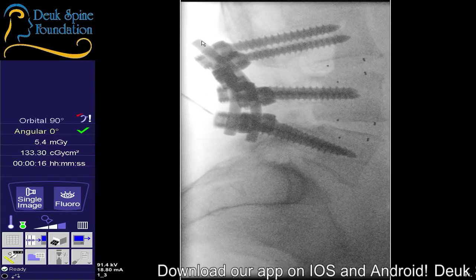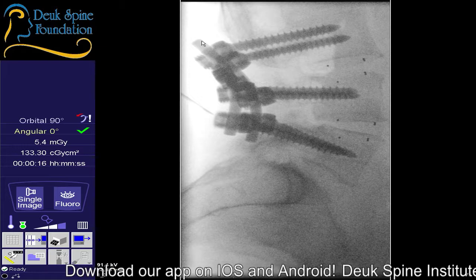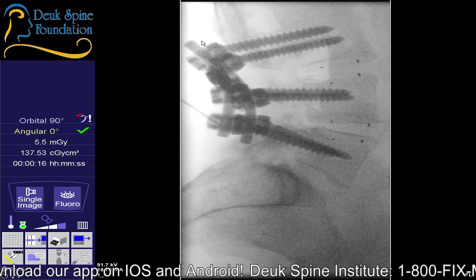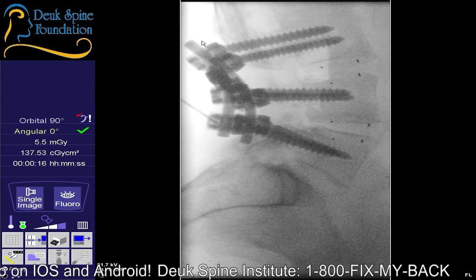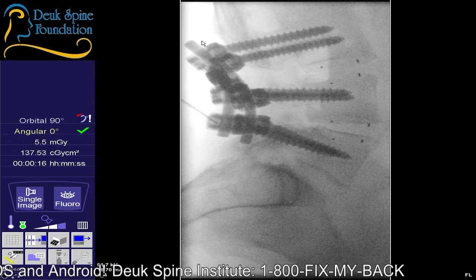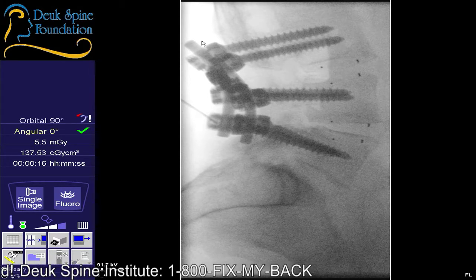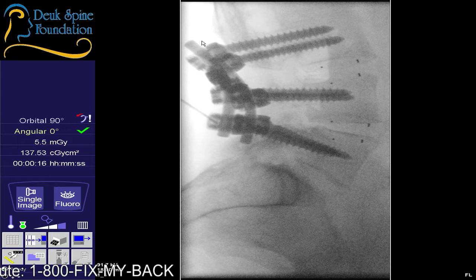No, you're okay. I can give her some local. Shot. Where do you feel that? In your back? I'll just give her a little bit of local. That should help a little bit. Yeah, I hadn't given her much local, so.